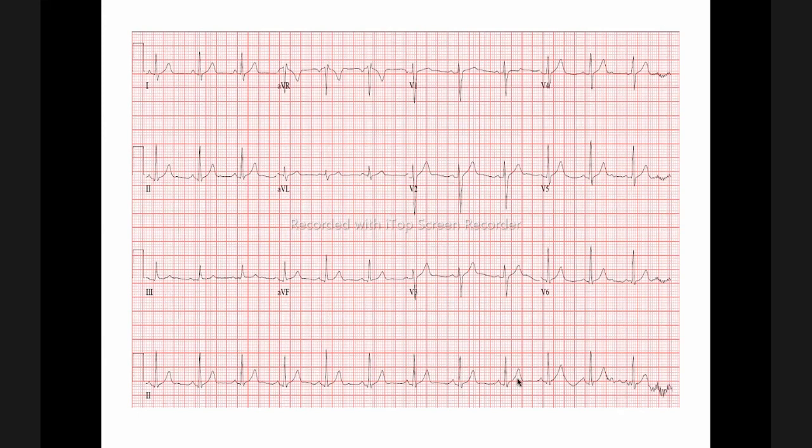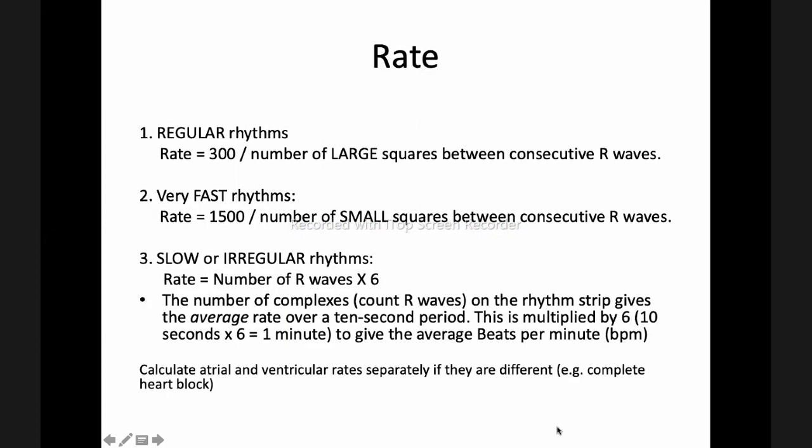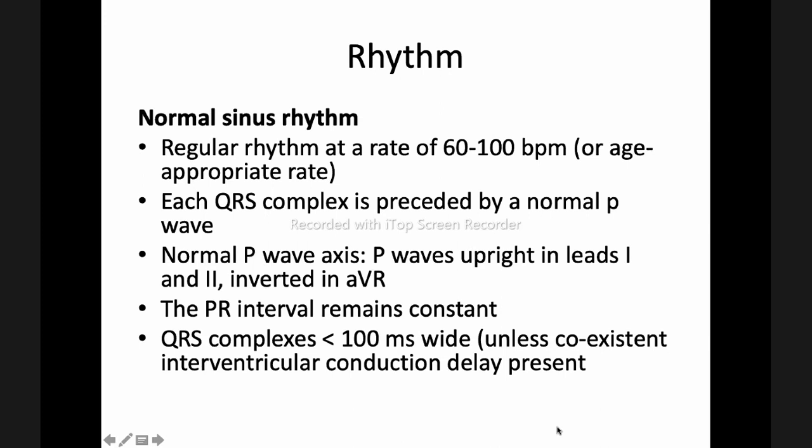That's your heart rate. If there's anything that you should take away from this particular lecture about the ECG, it is knowing how to at least count the heart rate. It will save your patients. I was impressed once with a sixth-year student who brought me an ECG, because I always send sixth-years to do ECGs themselves, so that they learn how it's done, and things stick much better in your brain. You don't have to memorize too much. Even axis, you don't have to memorize when you've done the ECG yourself.